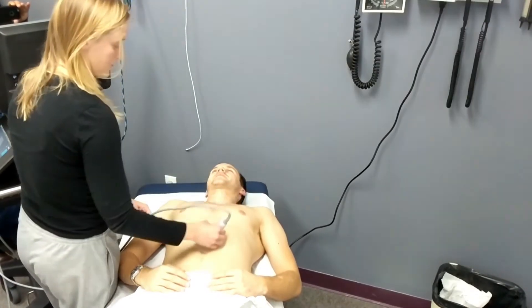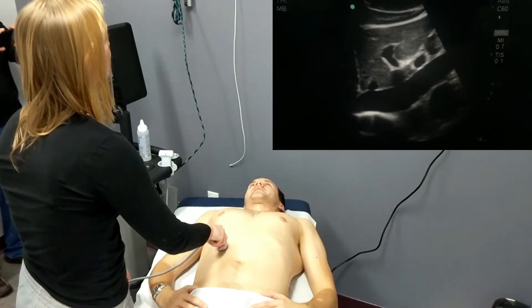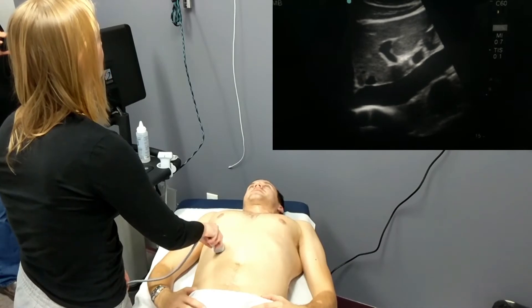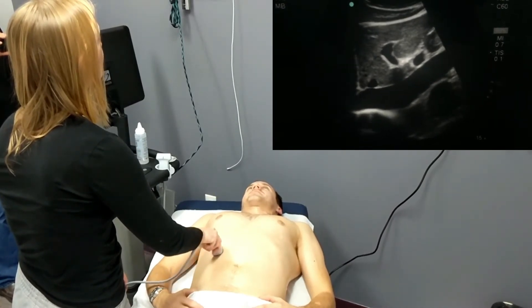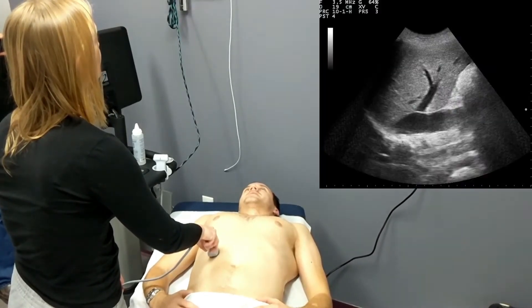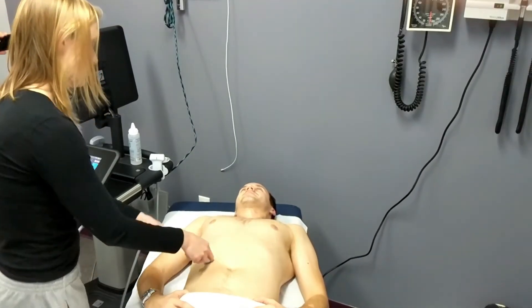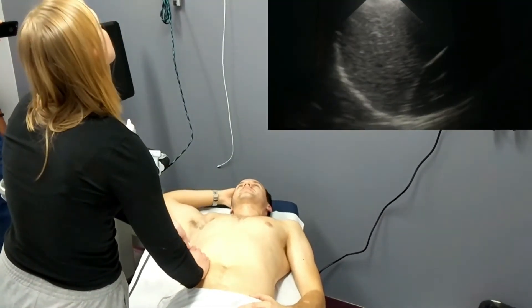Now our student is going to move on and look at the inferior vena cava. She's measuring the area of the IVC that is 2 cm caudal to the site at which the hepatic vein connects to the IVC. She's watching as the patient inhales and ensuring that there isn't a decrease of more than 50% in diameter with inspiration.